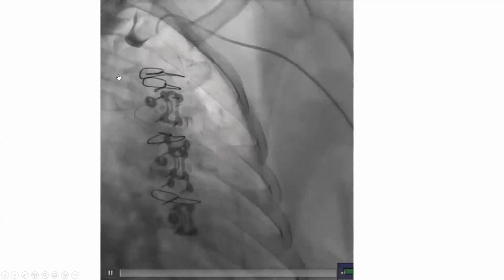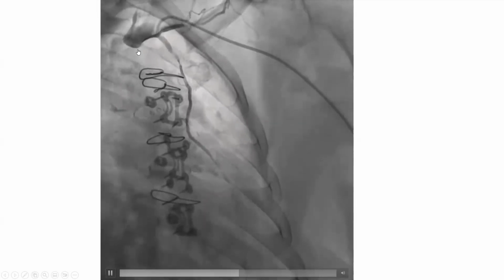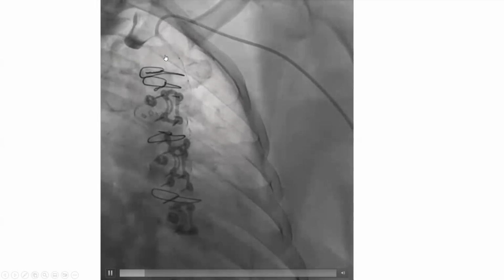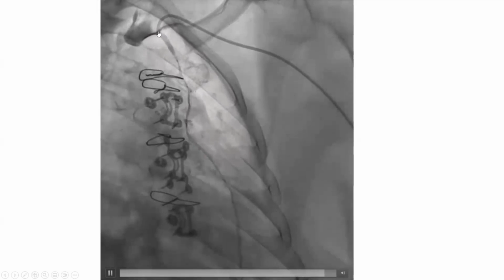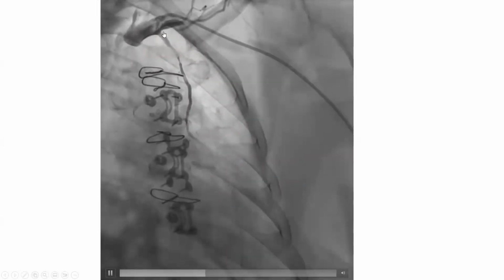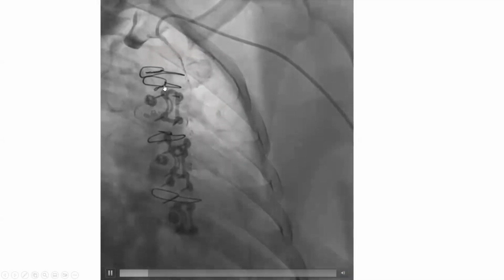Somebody here may decide to get femoral access, wire the subclavian, and try to stent the subclavian. No, keep it simple. We have a wire across here. We know how the dissection happened. It started here and propagated retrogradely into the proximal subclavian, to the more distal subclavian, and antegradely into the LIMA.